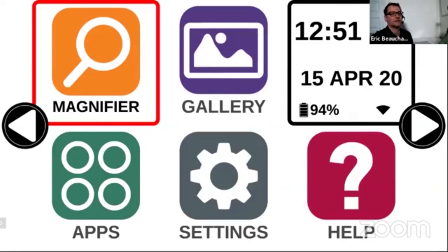So unfortunately, that's why this navigation was added, so that you can scroll through the buttons, and a very low vision user can use this. So it's very powerful, and you can go through all the buttons. And like Nadi just told you, you can activate by pressing and holding two fingers on the screen, and then swiping through the buttons on the button banner. Once you're done, tap anywhere on the screen, and it's going to activate that.